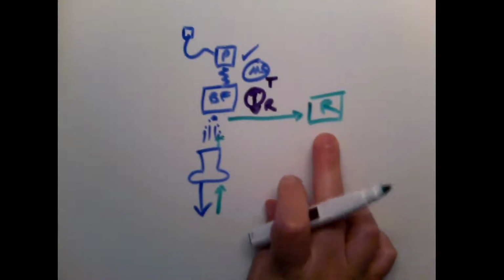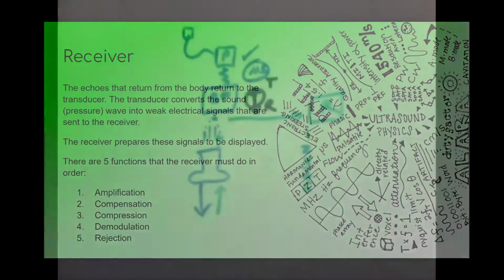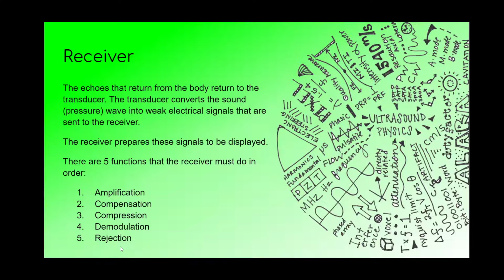Now we're in receive, heading over to the receiver, and we are going to process those really weak voltages that came back through 5 different functions of the receiver. The whole job of the receiver is basically to process those voltages and get them ready to be displayed on a monitor. There are 5 functions that the receiver does in this order, and you will need to know this order. Notice that they go in alphabetical order, so after you memorize what the 5 functions are, to remember the order, just put them in alphabetical order. We're going to go over each of these in more detail, but all the voltages coming back from the echoes out of the body are going to go through amplification, compensation, compression, demodulation, and rejection.